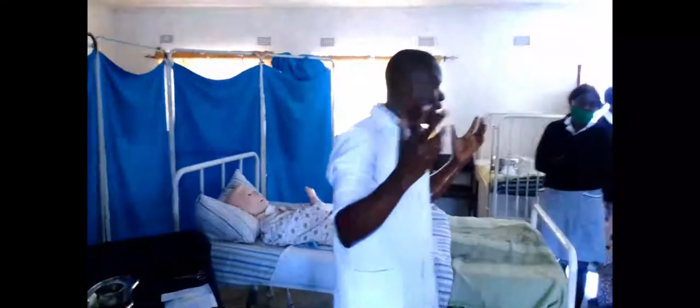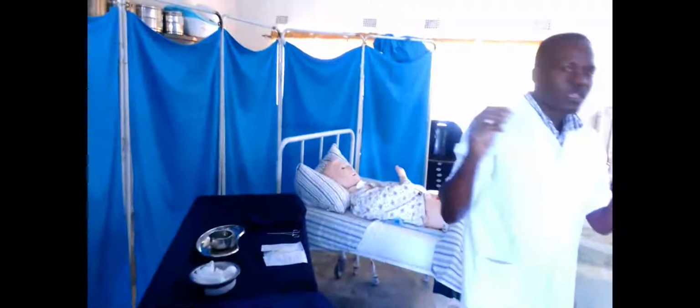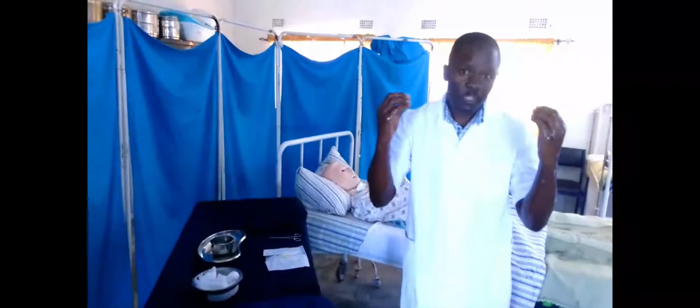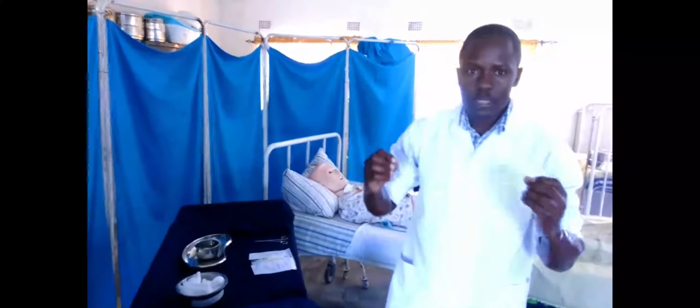So if you do practice, this procedure will be done quickly. If you notice the way I washed or scrubbed, it was brisk and quick. You just have to practice so that you get acquainted with the procedure. It's easy to scrub, as you saw.